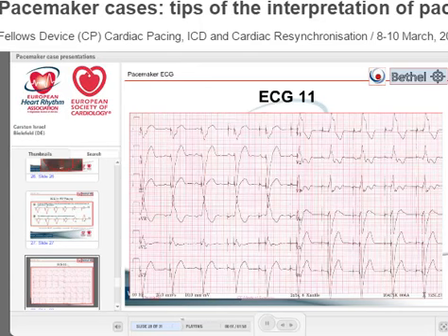I called the Düsseldorf University Hospital. They were laughing and said, well, look, these documents have long been destroyed. I asked if his family practitioner was somewhere. The patient was laughing and saying, my family practitioner died approximately 30 years ago. So absolutely nothing. I just knew he had heart surgery before. I put in the leads. This was the ECG result.